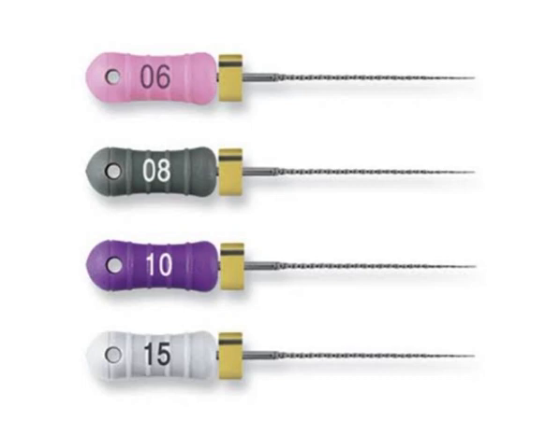Before that, we need to know that establishing a glide path is axiomatic when it comes to endodontics, because the glide path is the key. As John T. West defined, a glide path is a smooth, reproducible radicular tunnel that starts from the orifice level to the point at which the root canal terminates. To establish a glide path, we use manual files, and endodontics still is a manual key.